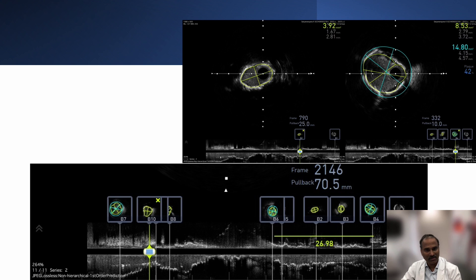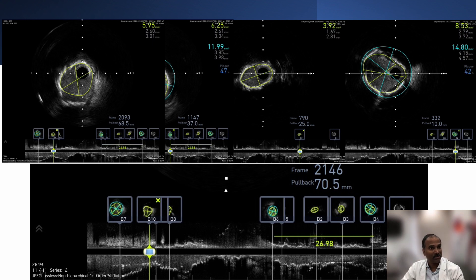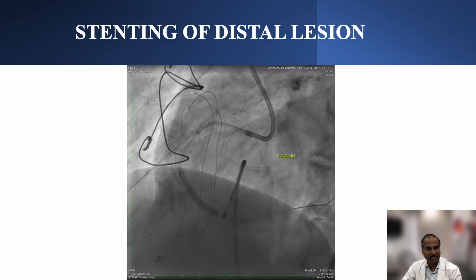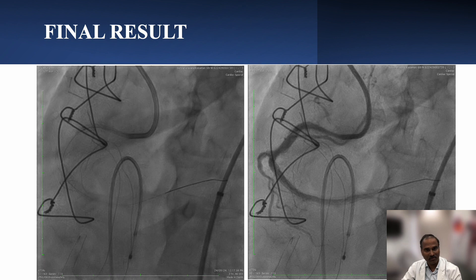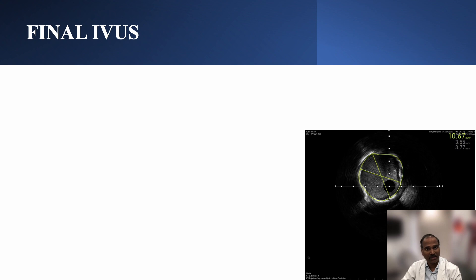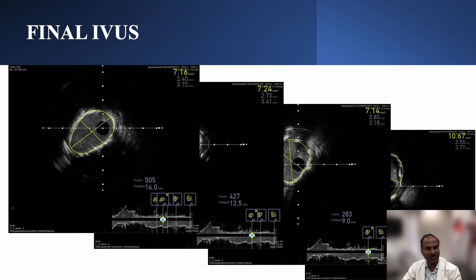Looking at the proximal lesion on IVUS — the most important lesion which had obstructed anterograde gear movement — it was only a calcium nodule, and after rotablation we have almost 5.95 mm² minimum lumen area, so we avoided stenting this area and stented only the distal lesion. You can see the final result with a little bit of slow flow, but acceptable. The final IVUS showed a minimum stent area of 7.2 mm² — a good result.